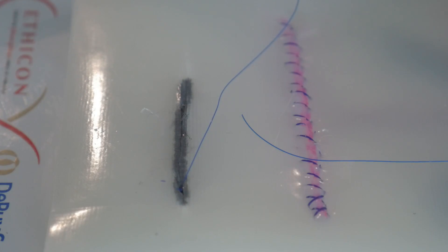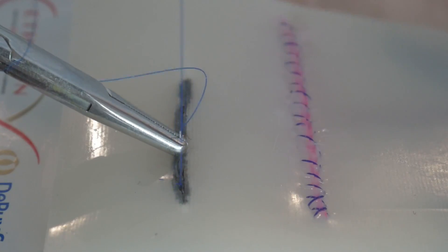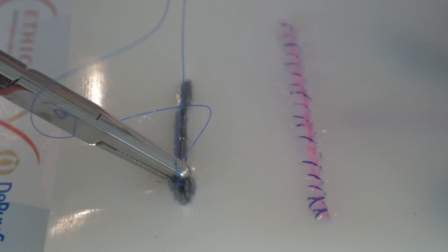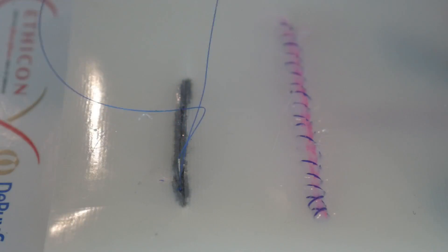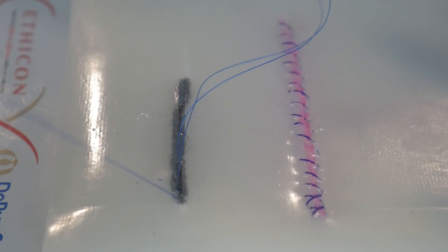So you can see on this next step here, as soon as the knot is tied, I'm going to hold the suture up with my offhand. And I'm going to take the needle and go right underneath the knot and come right out of the apex of the incision and pull the needle through. That ensures that the knot is buried deep down underneath and it gives me a good starting point at the apex of the incision to start my running subcuticular stitch.